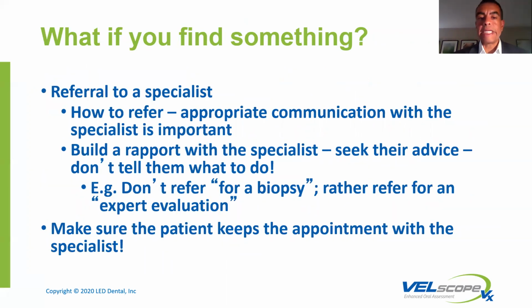So, obviously, if you see something suspicious, we're going to send that to a specialist for review. Please be aware, though, that we never want to say biopsy because you don't know. So we're going to refer you to someone to further assess that abnormality. And then obviously that clinician will determine what the next steps are.